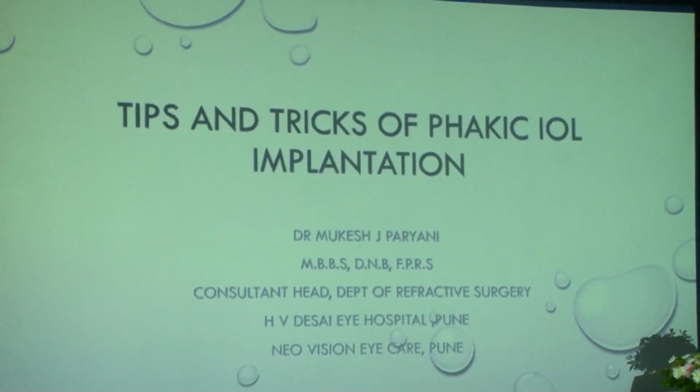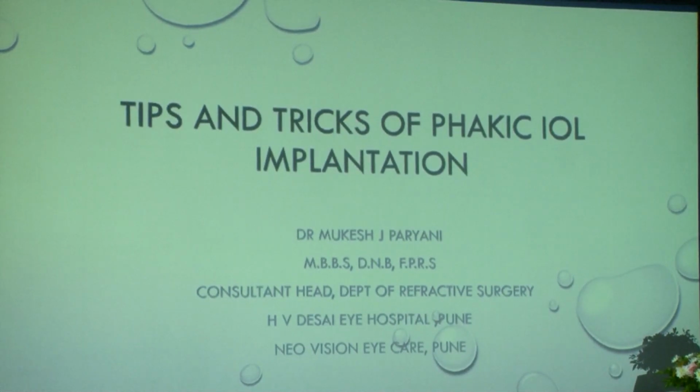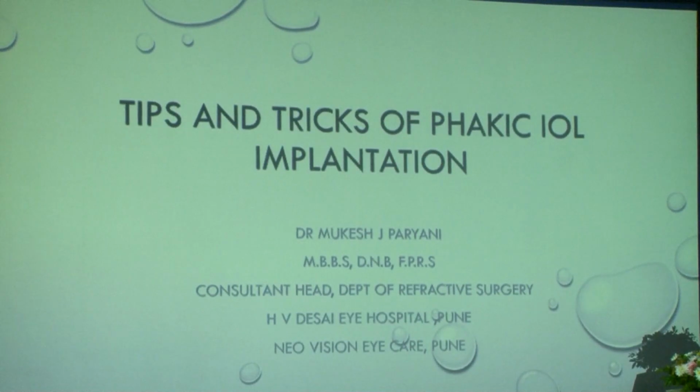And when it comes to hyperopia, the standard guidelines say that the ACD should be at least 3 millimeter, but it's preferred that the ACD should be at least 3.2 millimeter, because the vault and the cataract development in those hyperopic lenses are very quick, and they don't have a central hole.